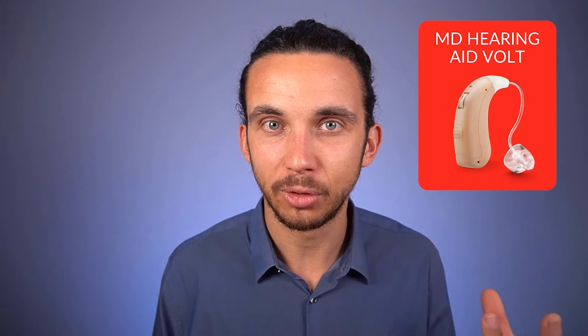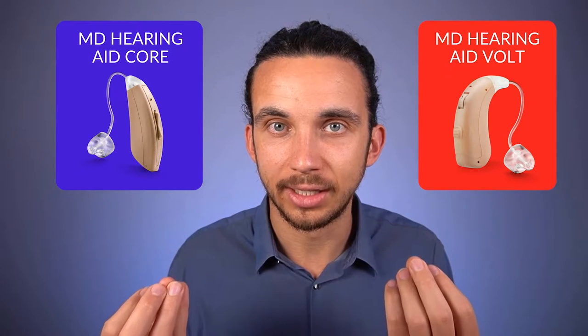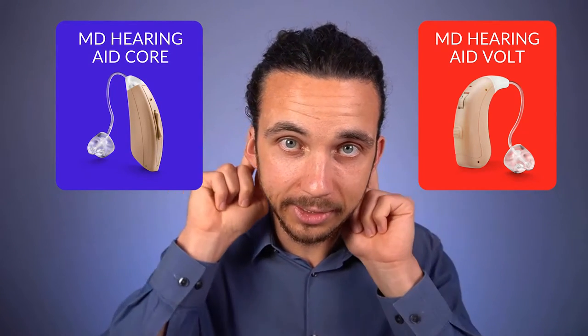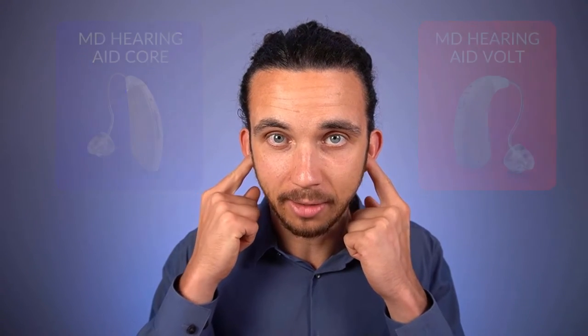The MD Hearing Aid Volt is slightly larger and the MD Hearing Aid Core is a little smaller. They both have hearing aids in the color beige that sit up and behind the ear with a thin plastic tube that goes inside the ear canal. When you're looking at someone from behind, the Volt is larger than the Core. They both have some basic function buttons on the device that you can press which will allow you to adjust the volume and change what's called the program.